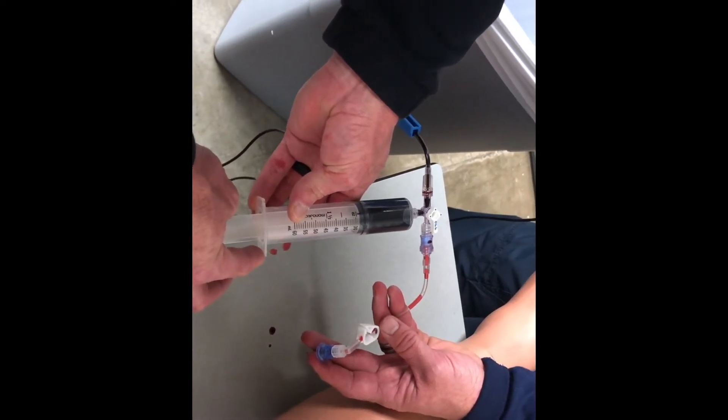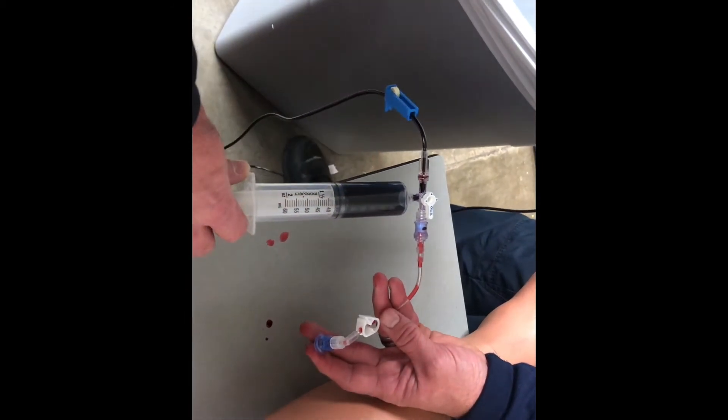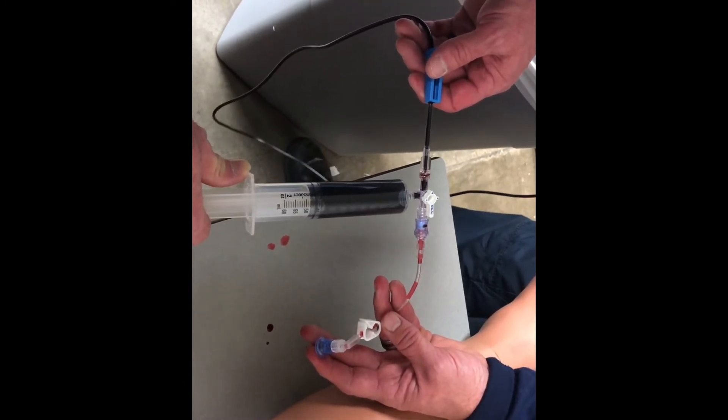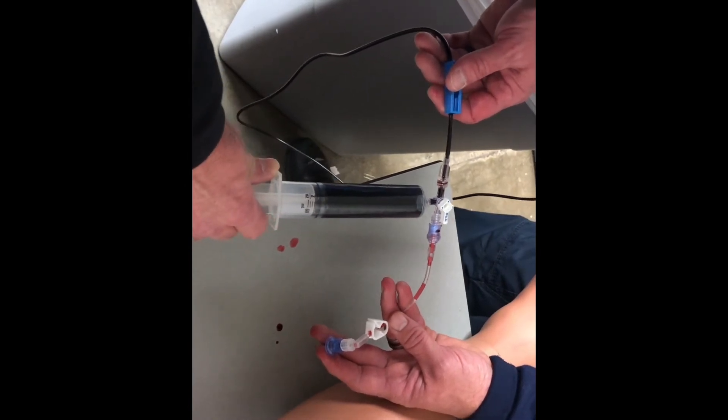It takes a little time because it's kind of thick — you've got to get air in there. Remember, you want to give this over 15 minutes. For an adult we're giving five grams, which is gonna be everything you have. It's gonna take you about three cycles of pushing and pulling to get the proper amount.